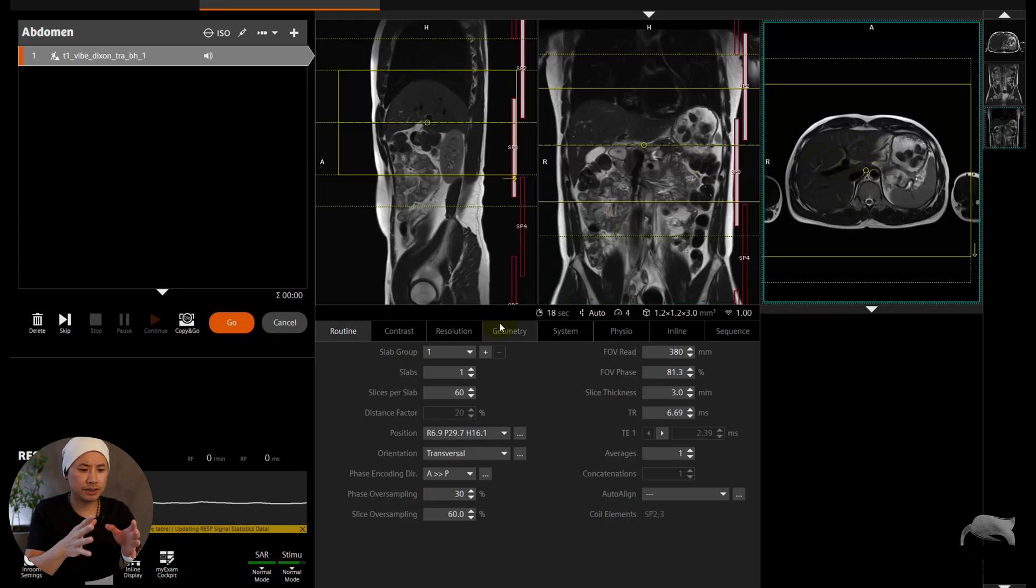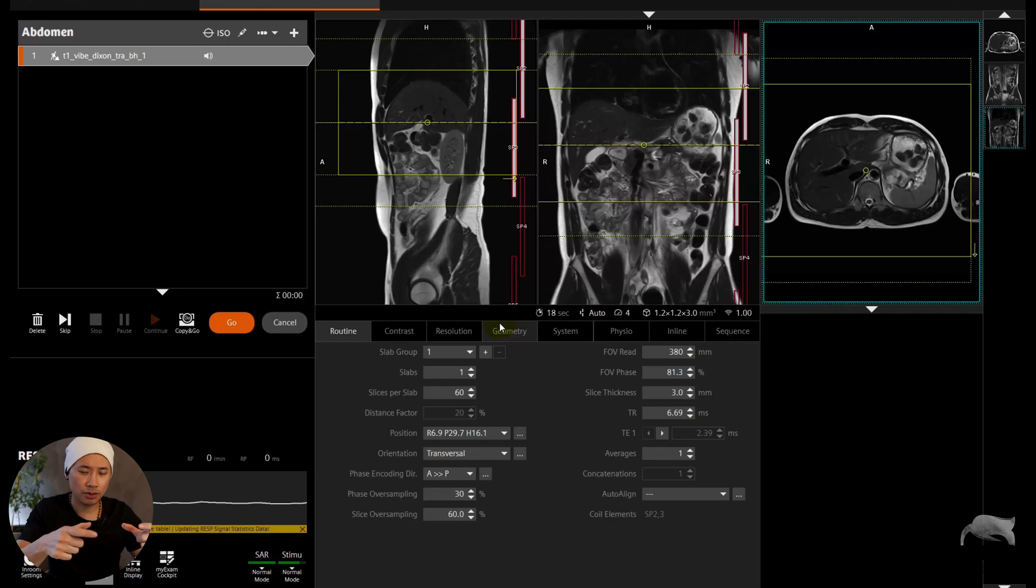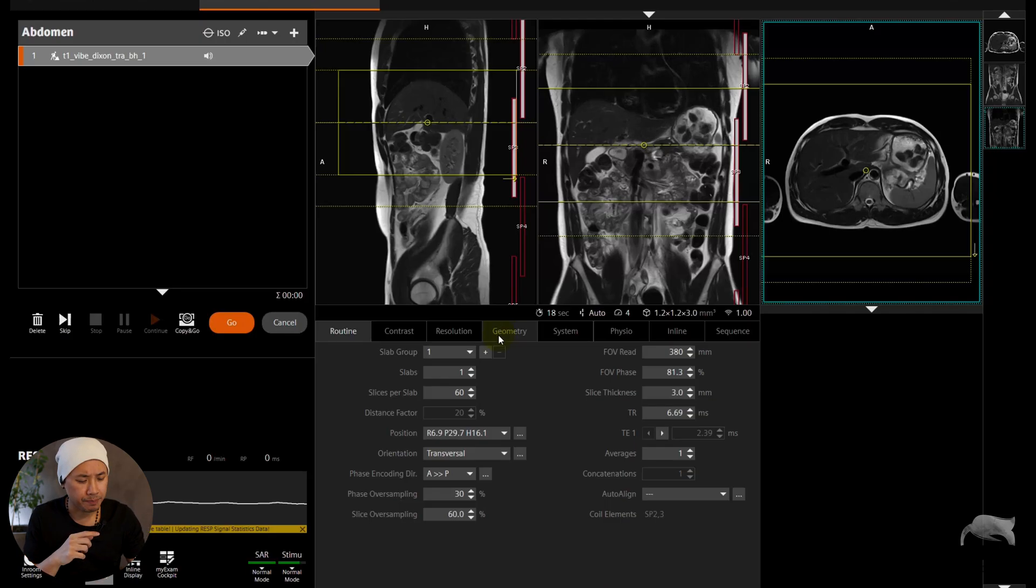In this case I'm just gonna lower a little bit of slices just to have two nice boxes which have good coverage and overlap. This one is good now for breath-hold covering the liver part, but we need also one for the lower part.